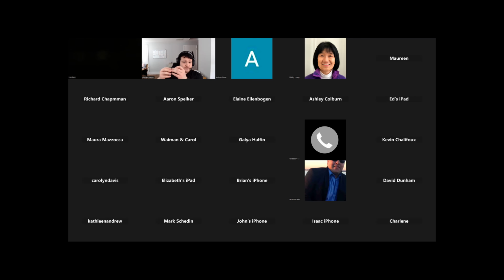It just clips onto the lapel, and I wish I had known about this in college, but I didn't know I had a hearing impairment at that time. Let me tell you, I did not do well in an introductory history lecture in a giant hall.